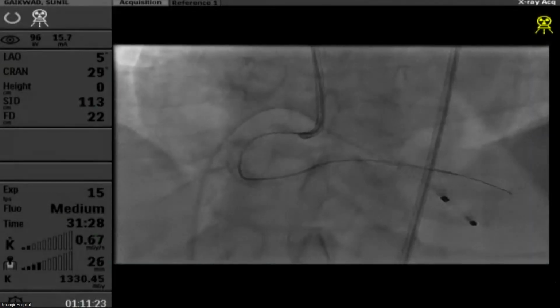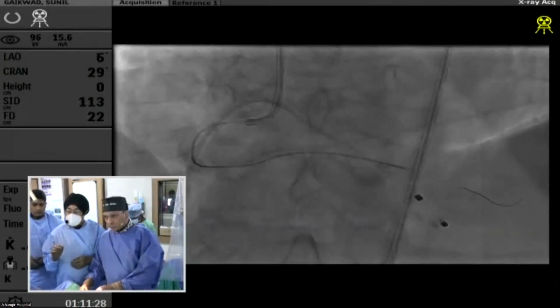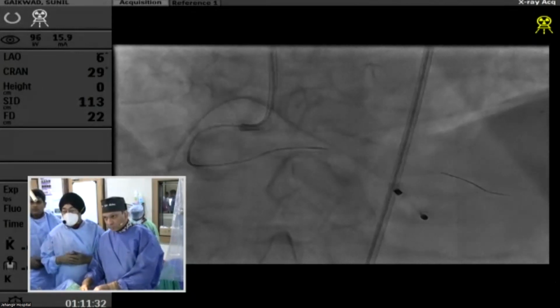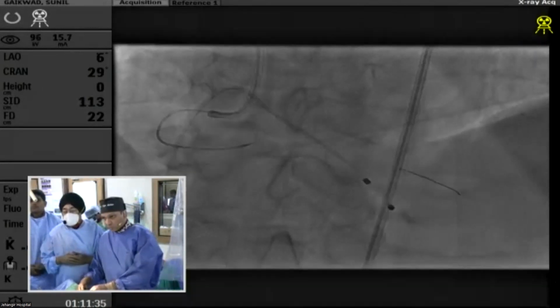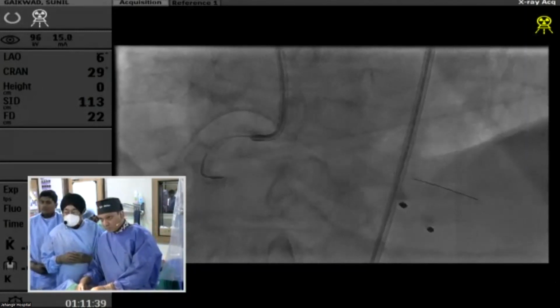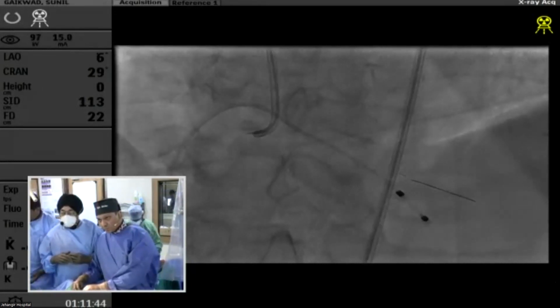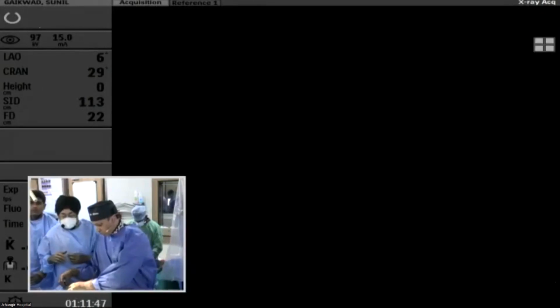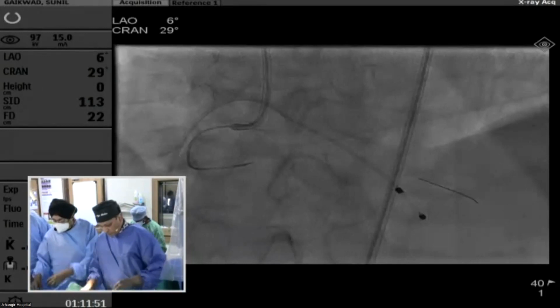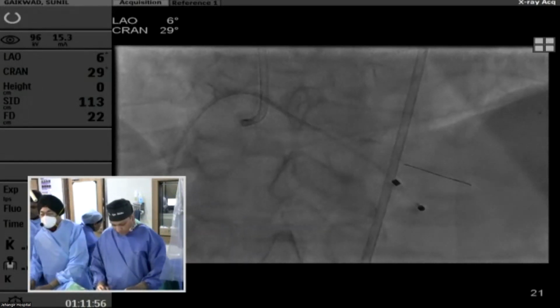If I show you the angio film when we did it, even the OCT catheter wouldn't go; after dilatation, with great difficulty, using a guide liner, we were able to take it. Moreover, here we use the benefit of imaging also. After imaging of the RCA, we know it's an eruptive nodule that has caused the ACS, number one. Number two, there is no intraluminal thrombus. We know that this coronary artery will not cause so much problem as far as rota ablation is concerned. That is how we can use imaging in this setting also.